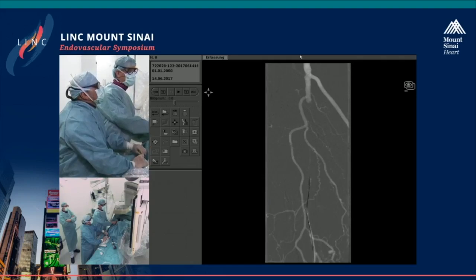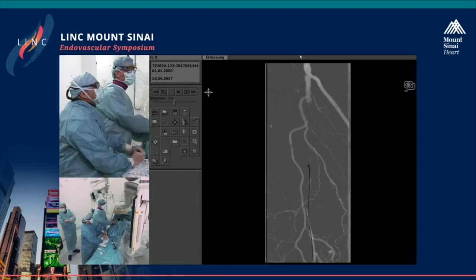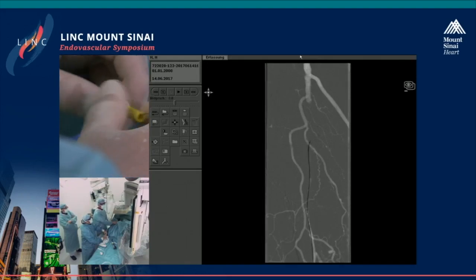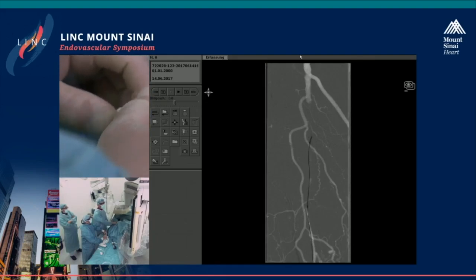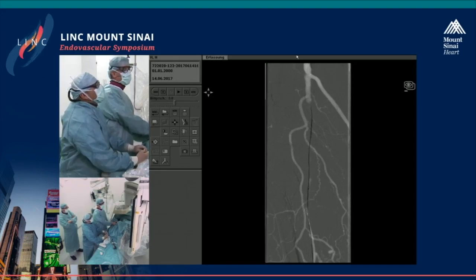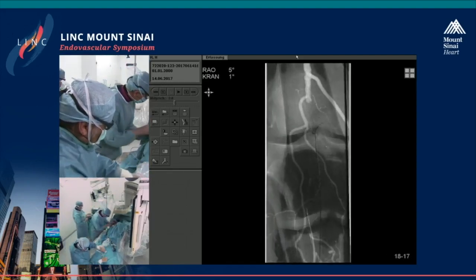I follow you. Oops, sorry. We can, I think, also create a loop if you want and push it. Yeah, sorry. You want to loop or, perfect. Marco, what do you think? Would you first take the wire as straight or directly loop it here? We have very few resistance. Okay. It's quite soft. So, okay, I follow a little bit. And, okay, perfect. Wonderful. Very soft, actually. Yeah, nice.